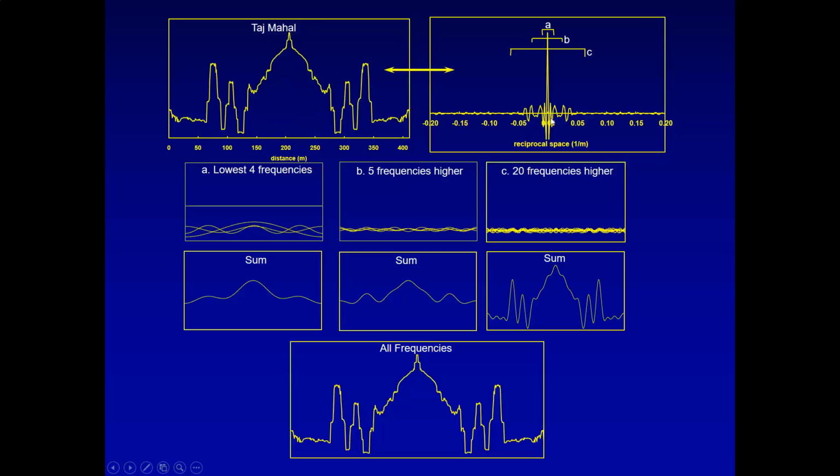And so when you have a large space, there's not much changing from this part of the object to this part. Whenever there's not much changing, that means there's very low frequency. So at 0 in reciprocal space, we have low spatial frequency. That means there's not very much changing.